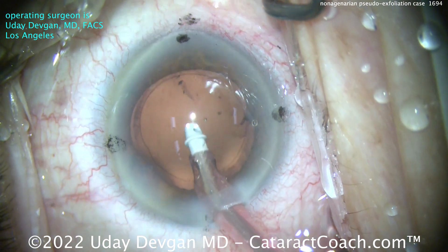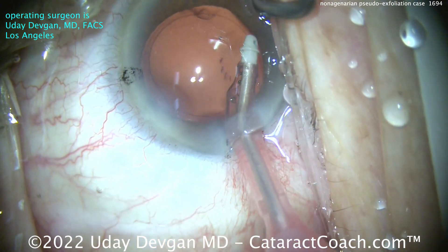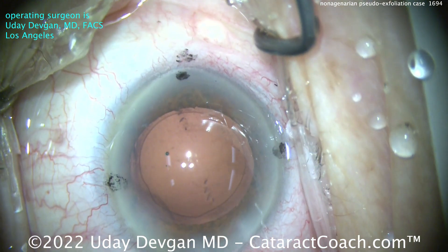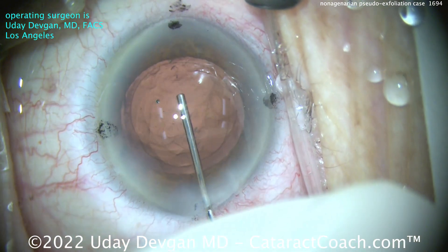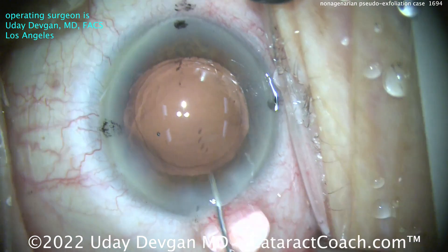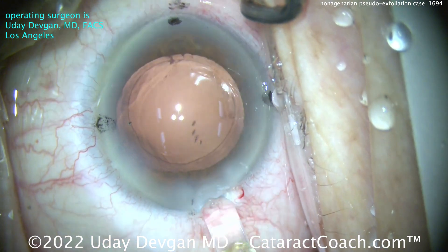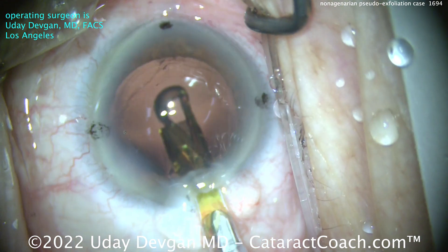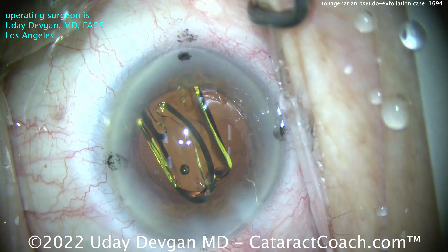The capsule looks really good. You can see on the cornea those dots marking the steep axis, which is somewhere against-the-rule. That's where we're going to line up our toric IOL. Our cohesive viscoelastic is going inside to fill the capsular bag — nice, good fill. Good-looking rhexis. Let's get that lens injected. The black marks on the cornea are just backup marks; we're not really going to use those. Injecting that lens inside the capsular bag — let's get that thing opened up.